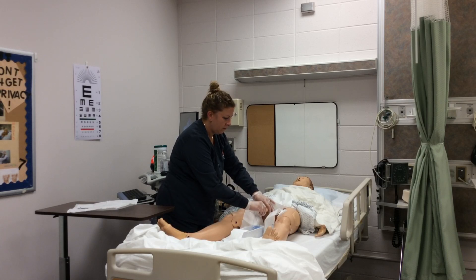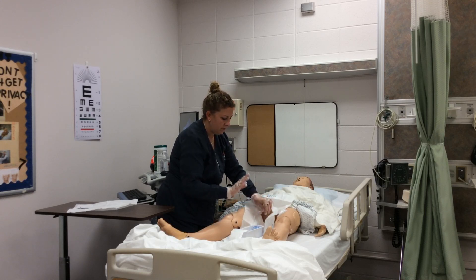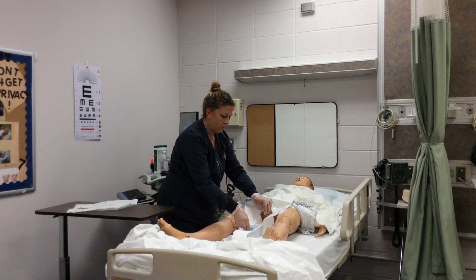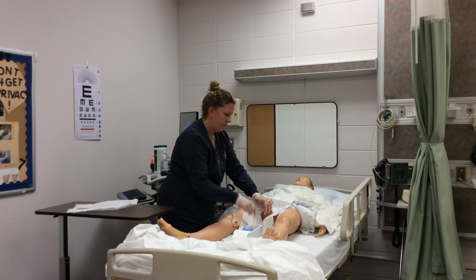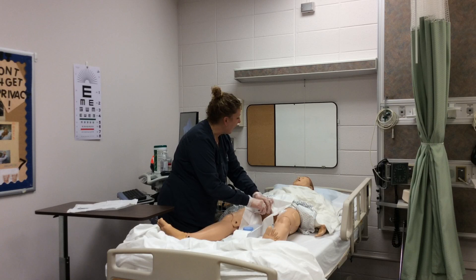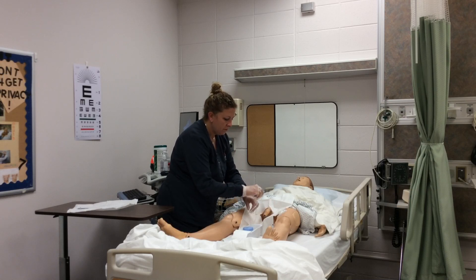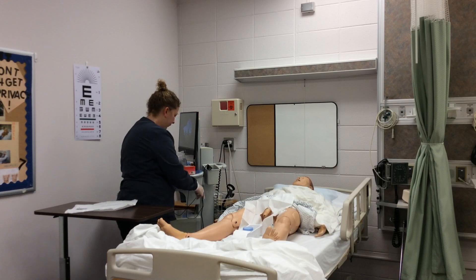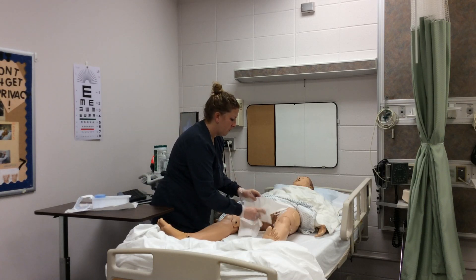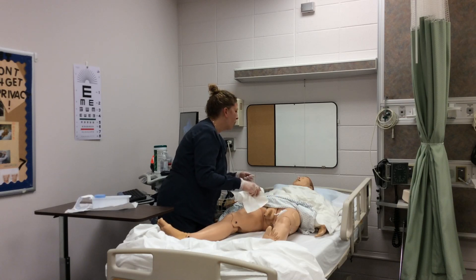She allows the bladder to empty fully unless volume is restricted. If indicated by physician order, she collects a urine specimen as needed. She withdraws the catheter slowly until removed. She provides post-procedural hygiene as needed, replaces the foreskin if it was retracted, and cleans the patient, noting warm soapy water can be used as needed.